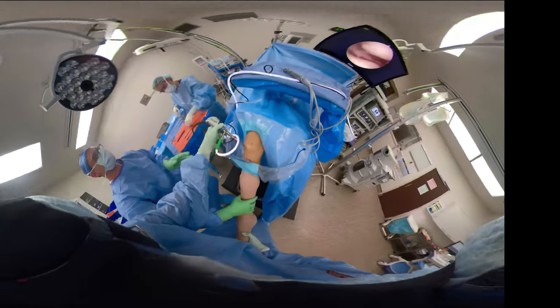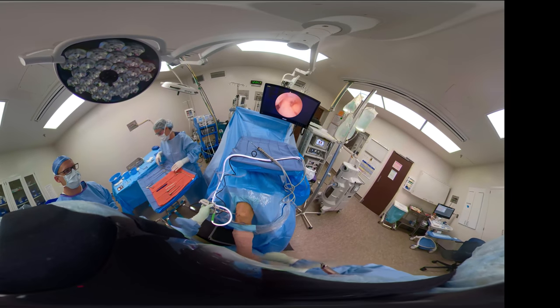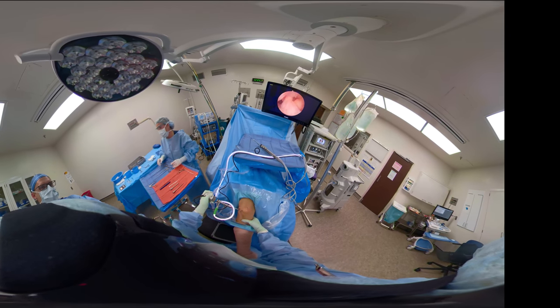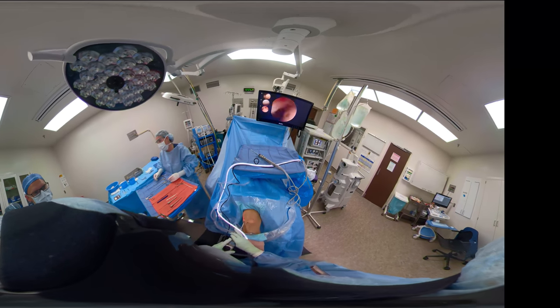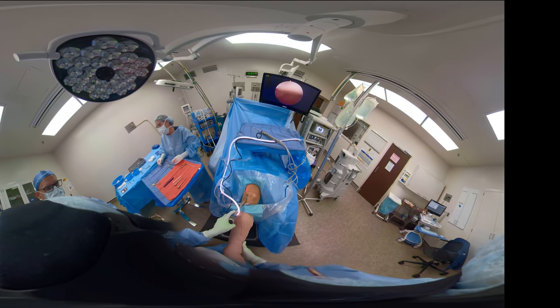So now I'll take the scope. I'm holding the scope with my left hand. That's the anterior cruciate ligament. And so now we'll do a quick diagnostic scope. This is the patella up on the top.